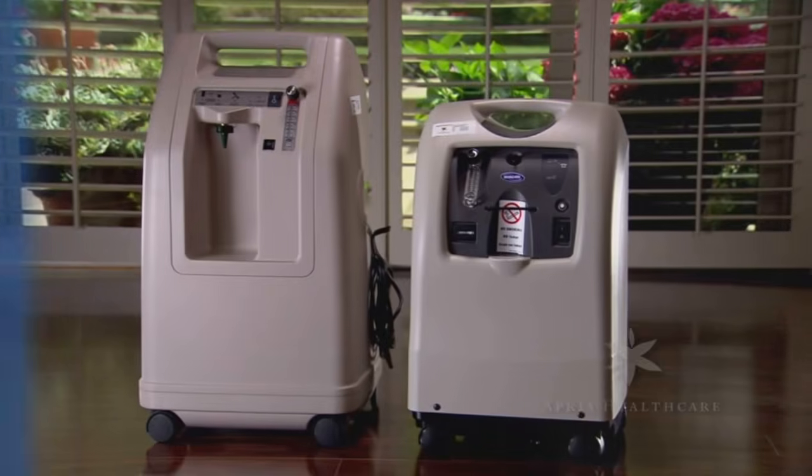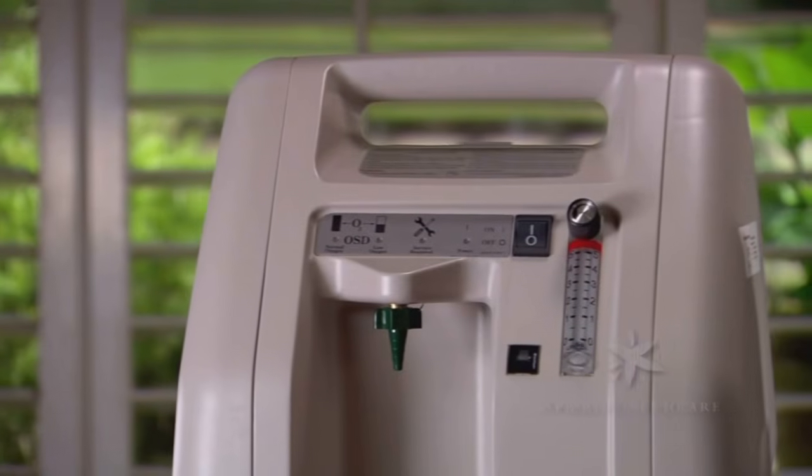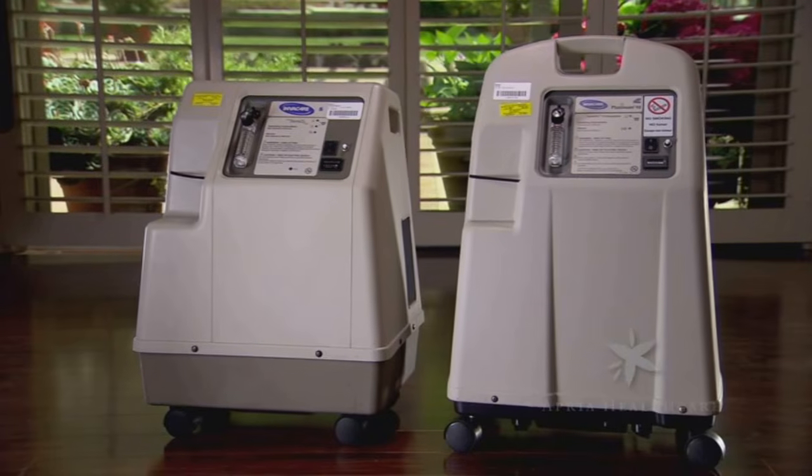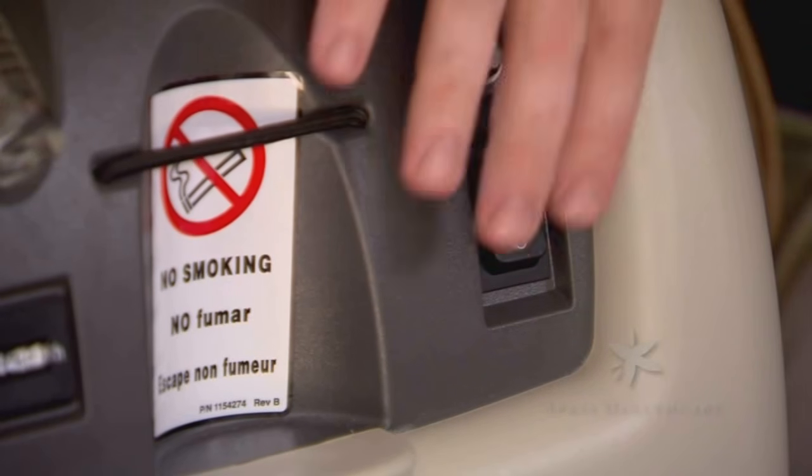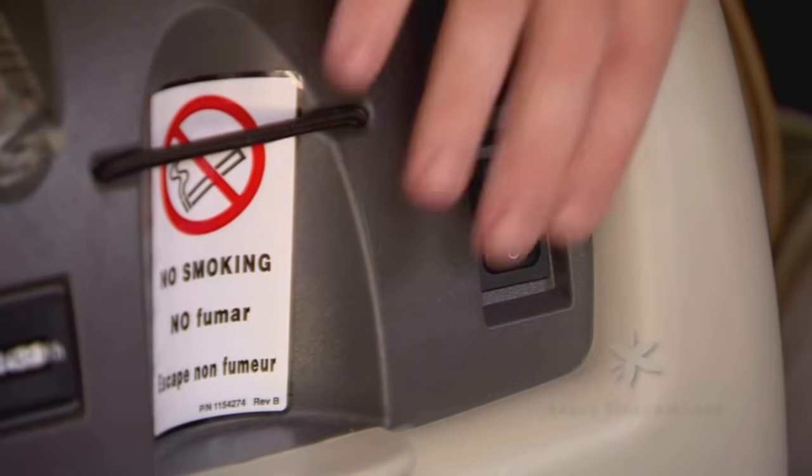Apria uses a variety of oxygen concentrators. All models have the same basic controls. Each unit has a power switch to turn the unit on or off that's located on the front panel. Almost all units are equipped with a circuit breaker or reset button.